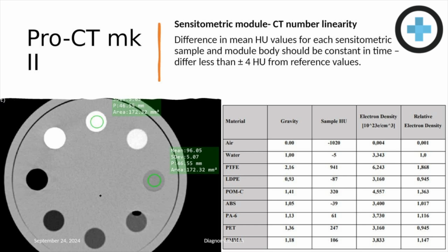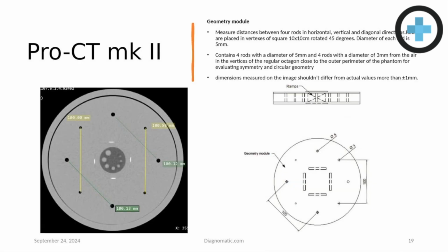So tumors also have characteristics, Hounsfield units, and they can be used to help distinguish them from normal tissues. So looking here, a variety of the different inserts that are standard, and then we also have optional inserts, and I'll point that out here shortly, of some of the different materials that can be tested as well.